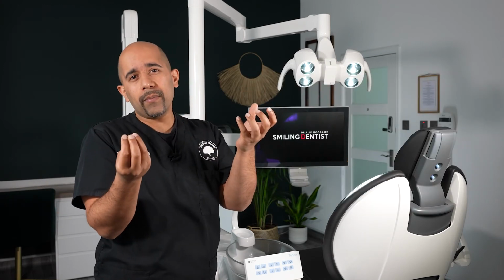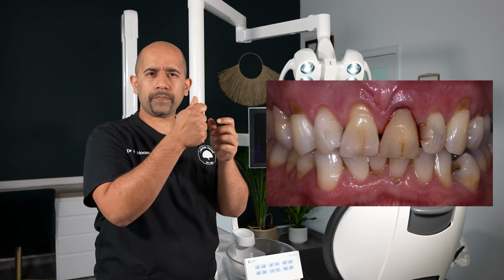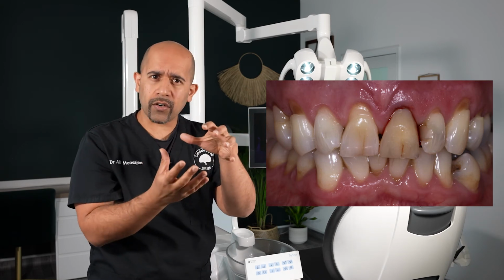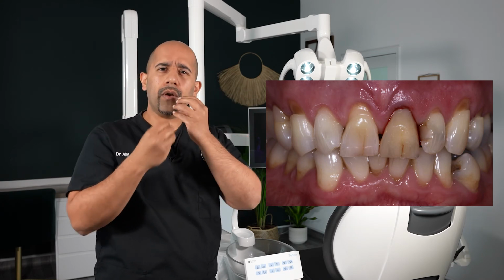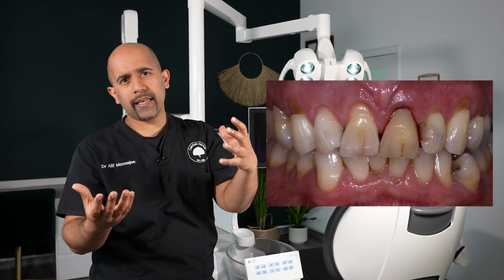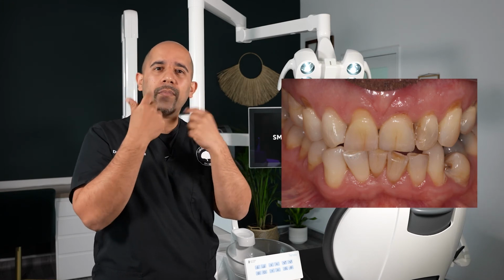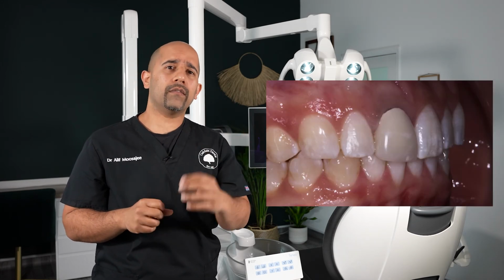Essentially what you're able to do then is to take a tooth out and put a tooth back in there and then. I find that you end up stabilizing the soft tissue profile really beautifully, and then when you move from your provisional restoration, which of course you must consider that you will make lighter in contact so that we're not loading the implant before it has adequate biological stability. But it means that when you remove the provisional, let's say 3 months later, and change it for the permanent crown, the gum will always be supported in the same way, and you really do end up with very nice predictable results by doing this treatment.